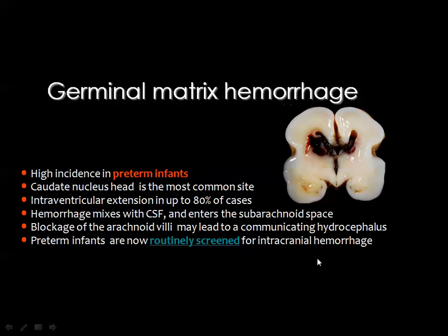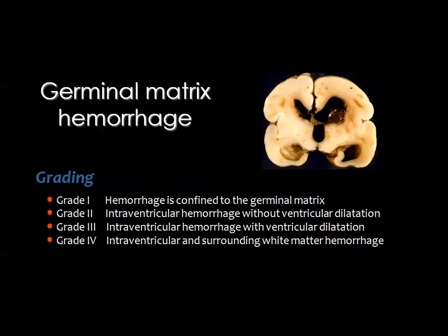One important note is that the preterm infants should be routinely screened for this germinal matrix hemorrhage, and the best way is, of course, by the transcranial ultrasound.